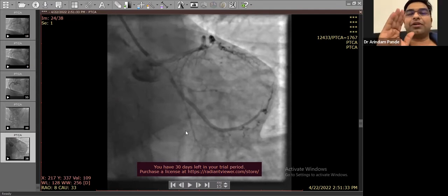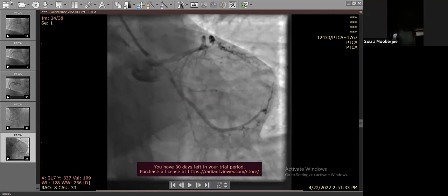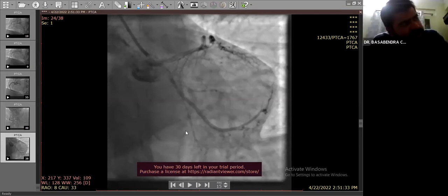Yeah, you have done a fantastic job. Now you have already done the angioplasty of the culprit. One option would be delayed. One option would be, if the LAD lesion appears significant angiographically, maybe we can do an FFR and confirm that the proximal LAD lesion is significant. Then we can plan a delayed CABG maybe. Otherwise, if PCI is the option chosen by the patient, then we have to do a bifurcation stenting, in my opinion, dedicated bifurcation. Yes, I agree with you.